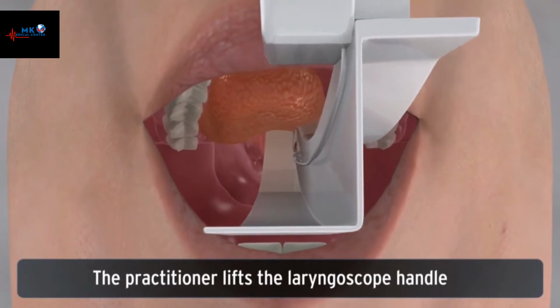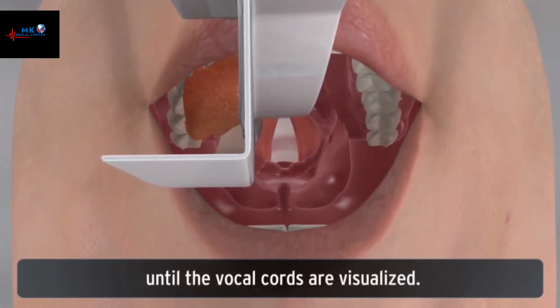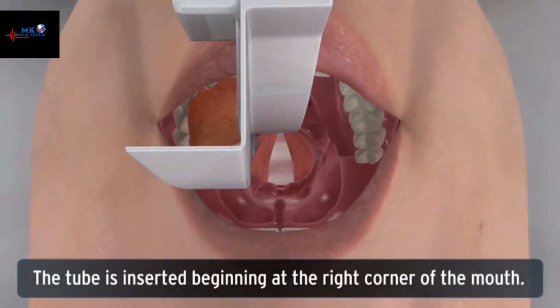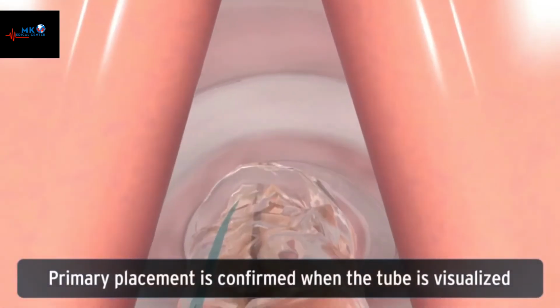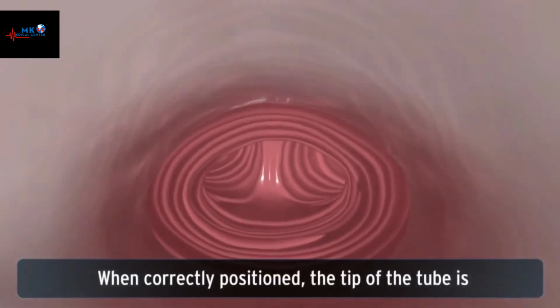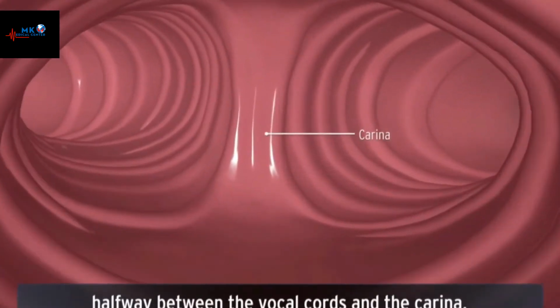The practitioner lifts the laryngoscope handle until the vocal cords are visualized. The tube is inserted beginning at the right corner of the mouth. Primary placement is confirmed when the tube is visualized passing through the vocal cords. When correctly positioned, the tip of the tube is halfway between the vocal cords and the carina.